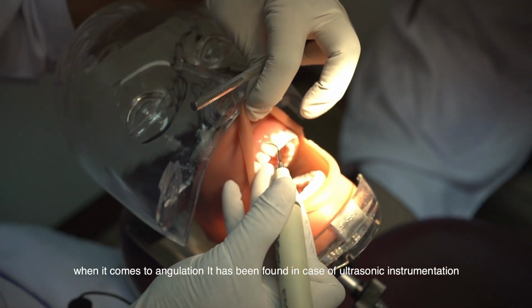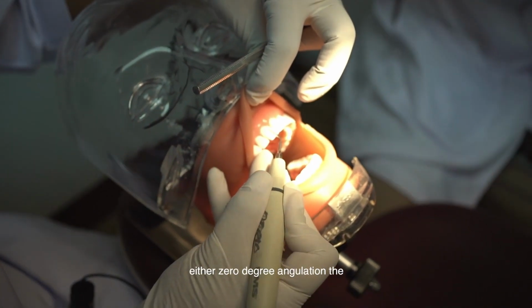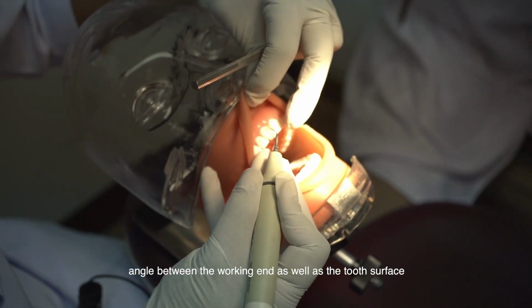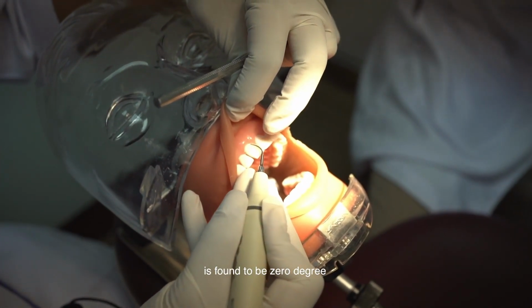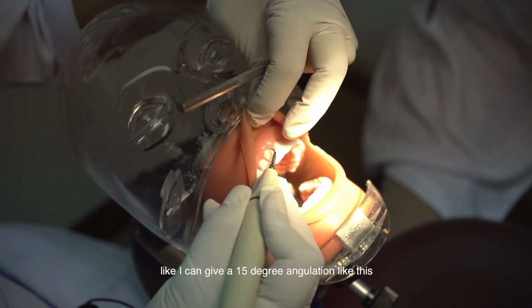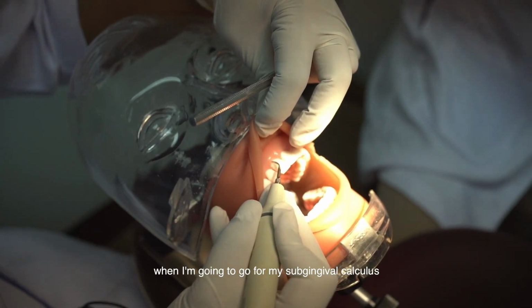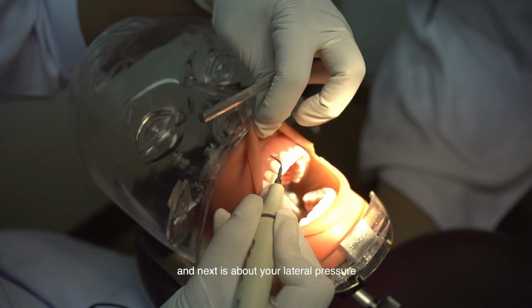When it comes to angulation, it has been found that in ultrasonic instrumentation, it is either 0 degree angulation, where the angle between the working end and the tooth surface is 0 degree, or 15 degree. I can give a 15 degree angulation like this when I am going in for my subgingival calculus or cervical calculus. And next is about your lateral pressure.